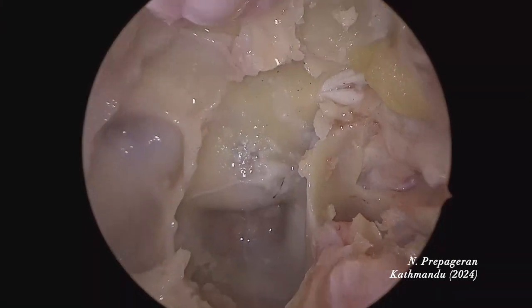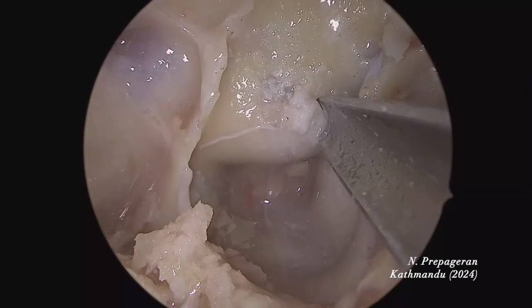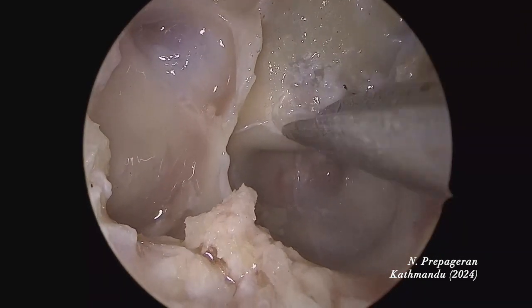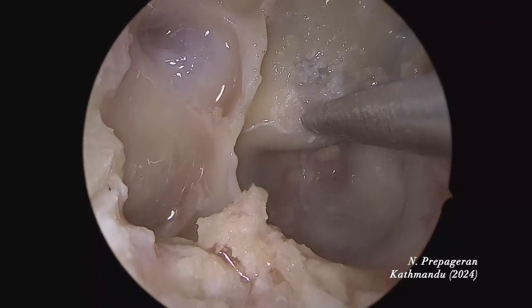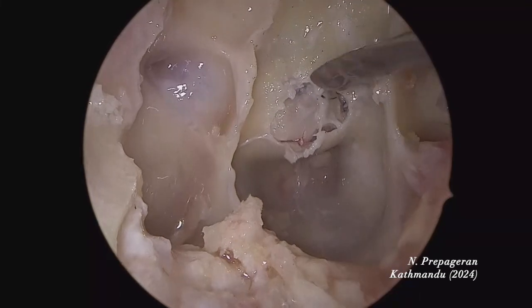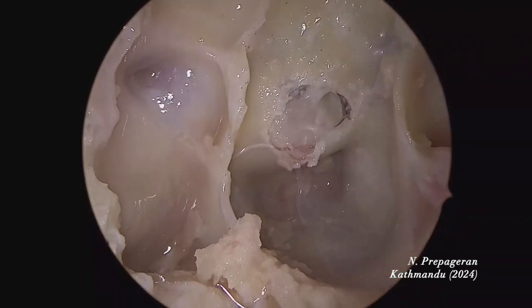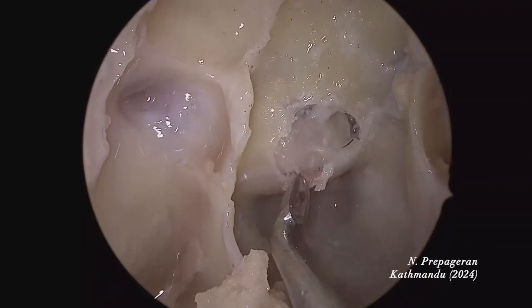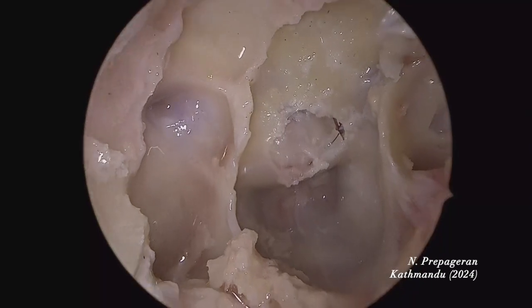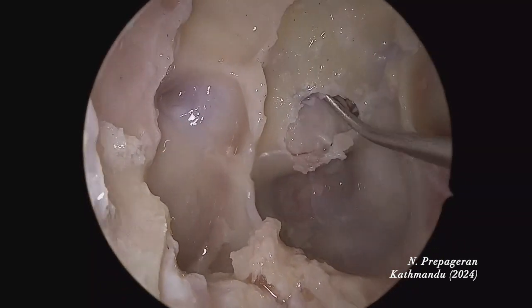Let's open the sella first. I'm going to open the pituitary now. Even now, Viki and I still do this sometimes — just to open up a little bit of the dura. All I need is to open up a little bit of the dura. Even when we use a drill, we do not drill the whole thing; we just use it a little bit to expose the dura and see whether we can lift out the bone piece.